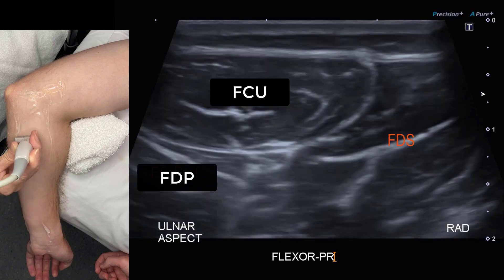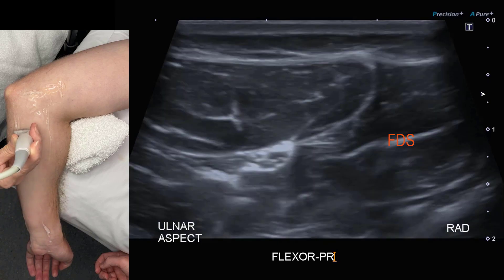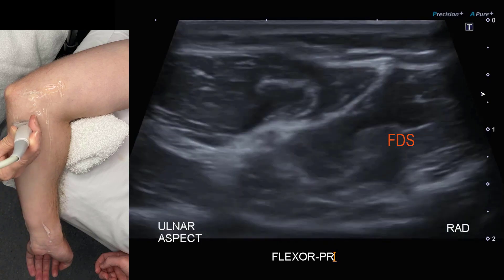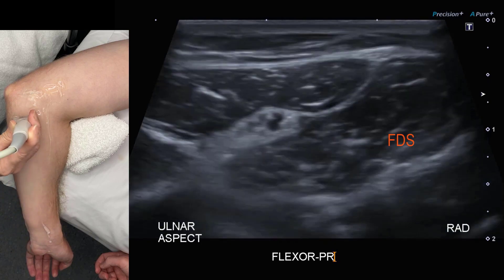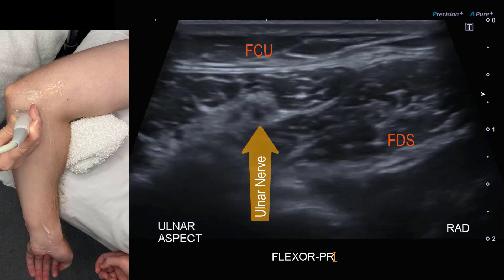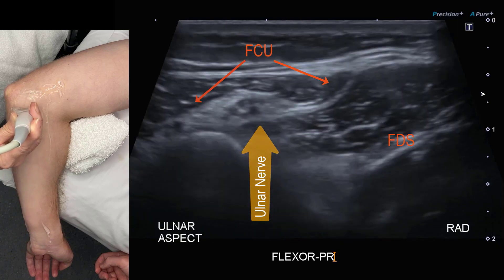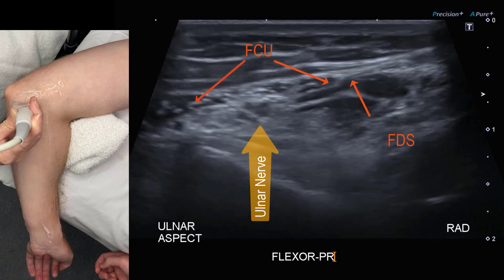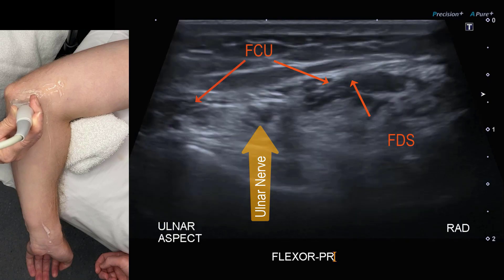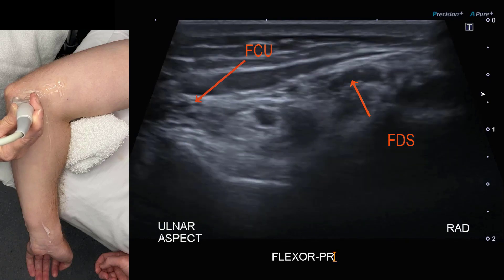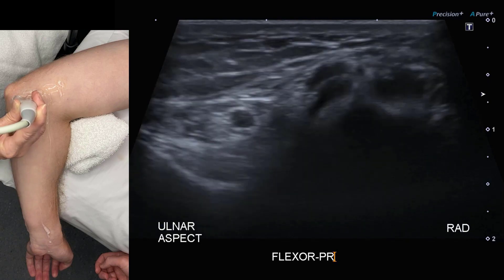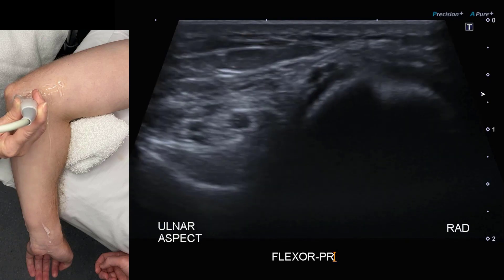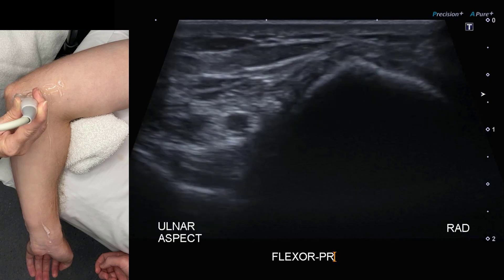You'll see those heads overlying the ulnar nerve, and the humeral head is the one that arises from the medial epicondyle, just posterior to the epicondylar ridge. You'll see a little ridge on the medial epicondyle just there, and behind that is our FCU.